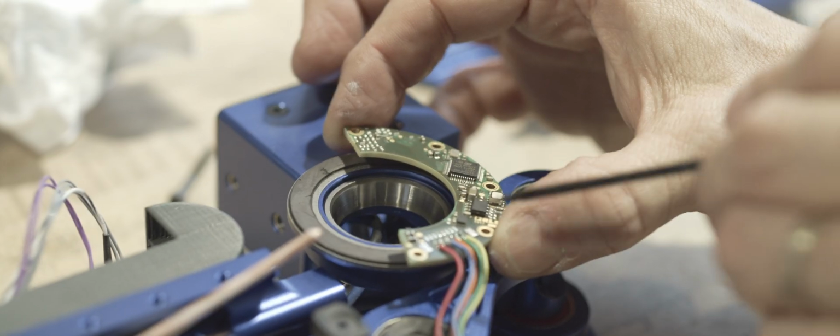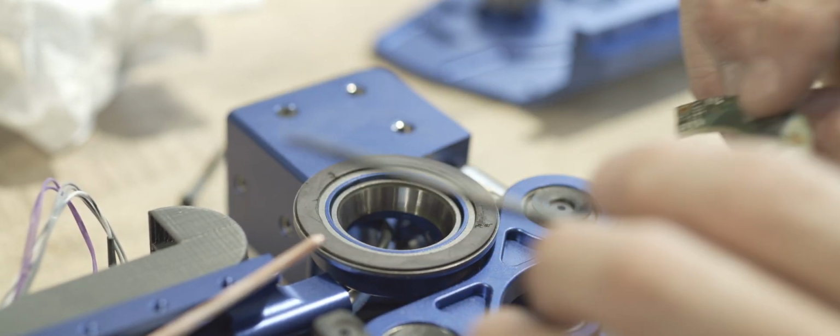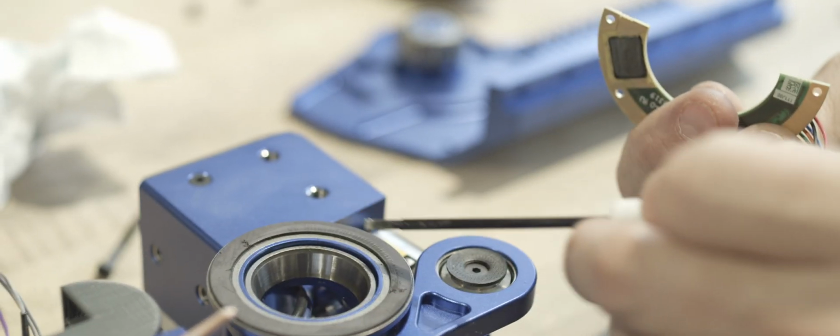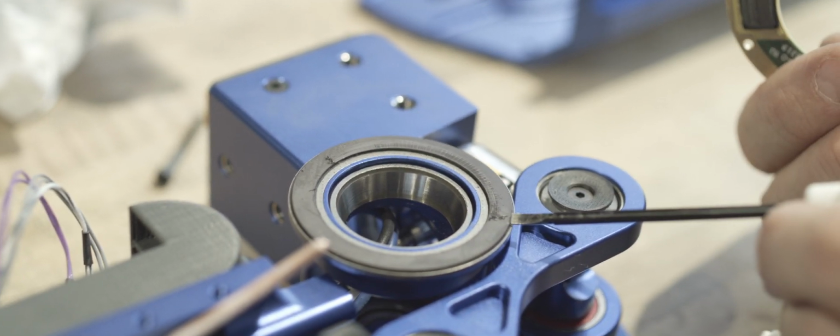This board was too close to the ring, so it's pressing against it. So as this rotated, this output rotated this way, the read head would rub on the ring. You can see like a rubbed area and then a pile of magnet ring.